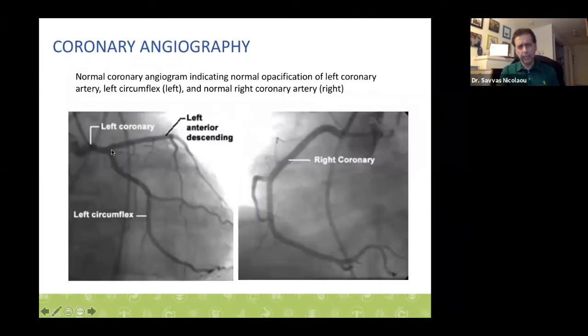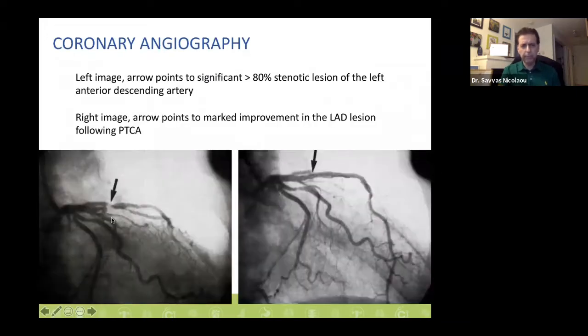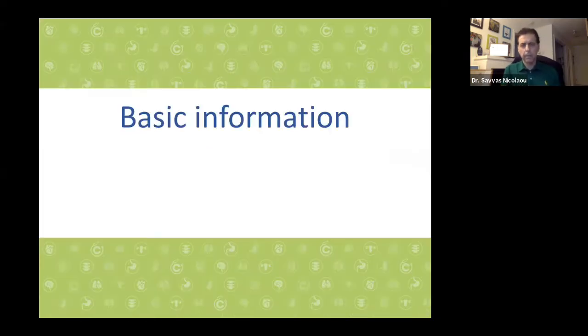So what we can do is cannulate the orifice of the coronary arteries and inject contrast material, looking at the left anterior descending coronary artery, the left circumflex, the right coronary artery. And then if we detect a stenosis, in this particular example in the LAD, we can do angioplasty and the deployment of a stent and reestablish flow across that area of the vessel. An excellent test, both diagnostic and therapeutic, particularly for high-risk patients for the development of an adverse cardiovascular disease event.